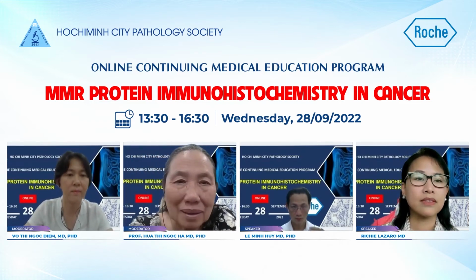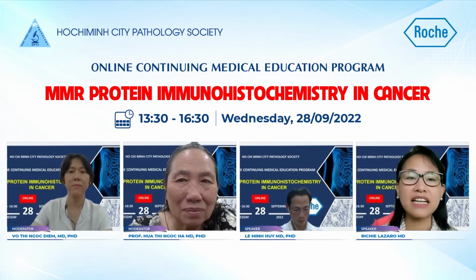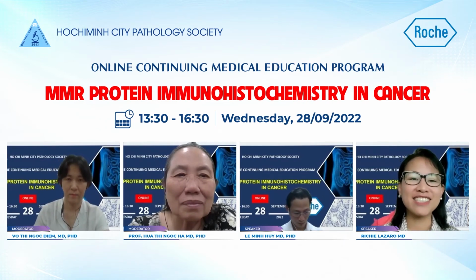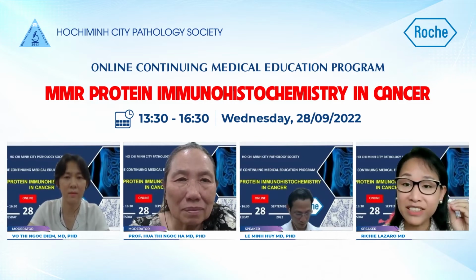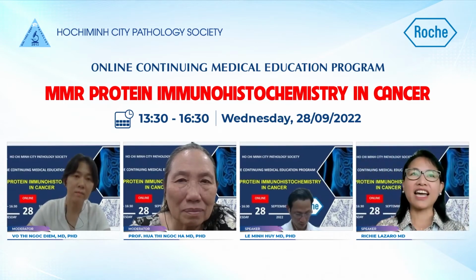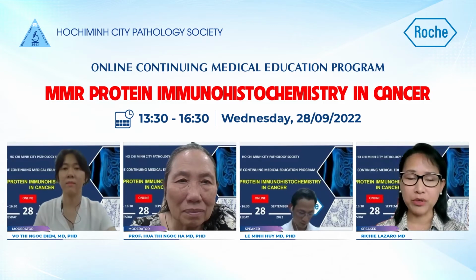Thank you, Mr. Richie. So if the case is less than 50 cells, how to handle the specimen or the situation? So this implies very, very small tissue, right? In a tiny biopsy, that's very possible to be encountered. And pathologists need to be judicious in our use of immunohistochemistry.